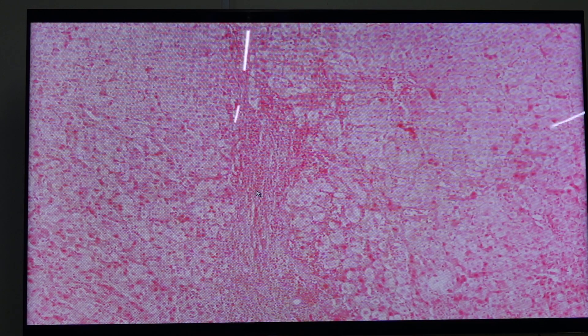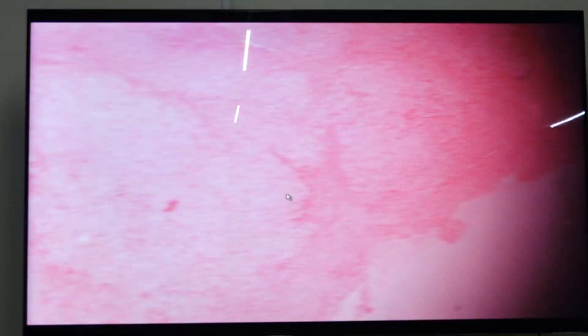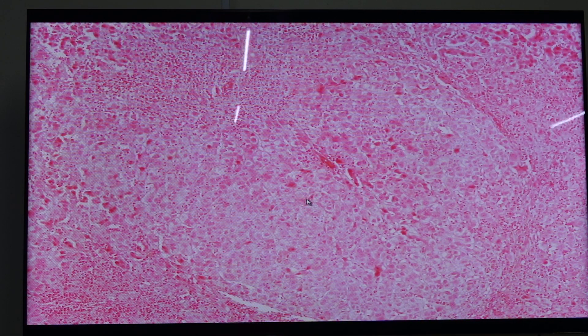There is a presence of dense mononuclear cell infiltrates. If some of the cells go into the parenchyma, we call it interface hepatitis. Notice the lines already forming with those mononuclear cell infiltrates — this would be a sign of bridging fibrosis and necrosis. You can still appreciate the ballooning degeneration of the hepatocytes in other areas of the slide.